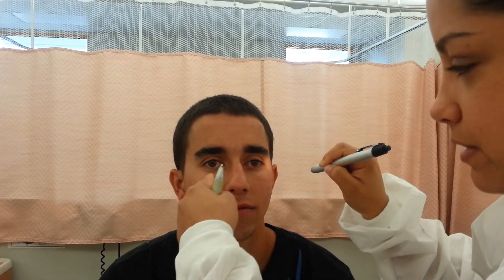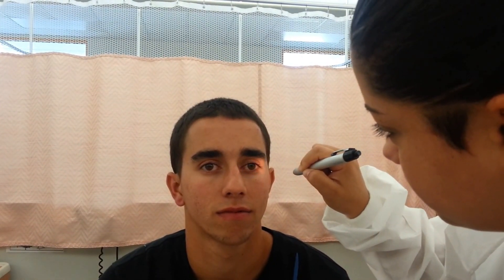Next is direct and consensual. So I'm going to use my pen light and flash the light in one eye to see what happens directly in that eye. Consensual is what happens in the other eye that does not have the light in it. Here's direct — I see the pupil constricting because the light's in it. Now I'm going to do consensual, and I'm going to see what happens in this pupil when the light is in this eye. And it also gets smaller as I flash the light.